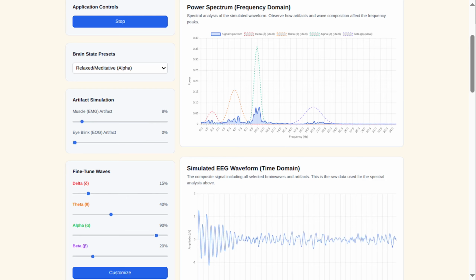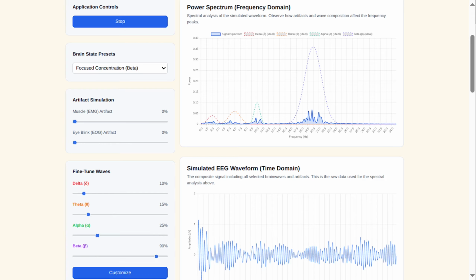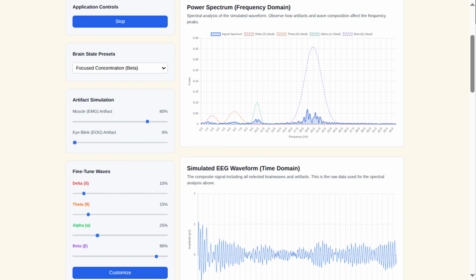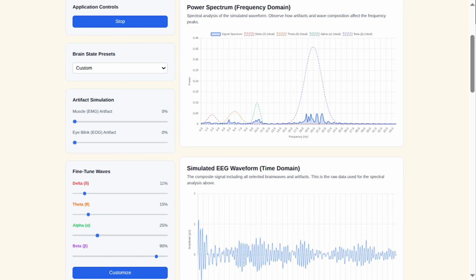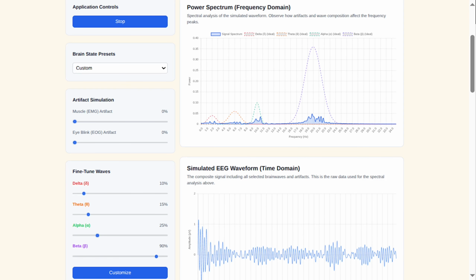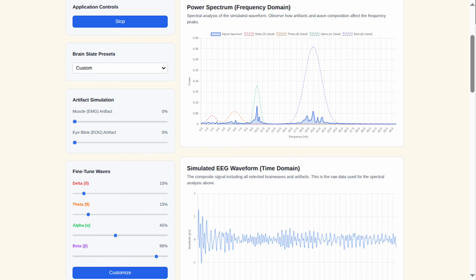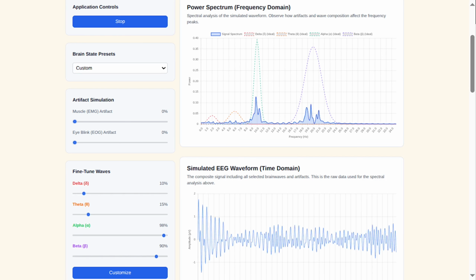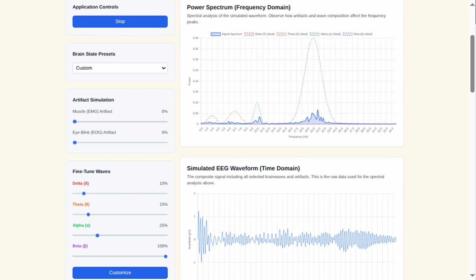But is there a difference between subscalp and periscalp? Subscalp is the correct term. Periscalp is not a standard term in this context. No, I meant periscalp, as in periskull. Ah, I see what you mean. Periskull is not a commonly used term in the field. The recognized term is subscalp, which refers to electrodes placed under the scalp.